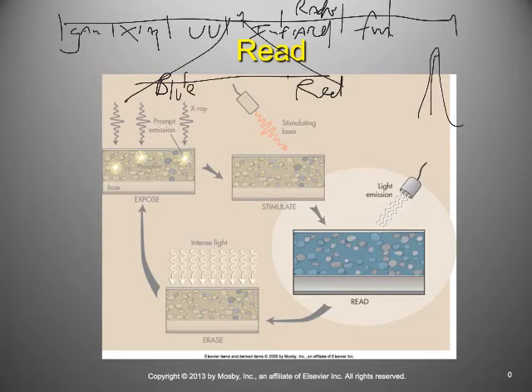The blue side of things is a spectrum. So as the laser scans over the PSP, it's going to emit a spectrum of blue light. And that spectrum is going to be more like a spectrum of energies. So it could be any level of these different blues.